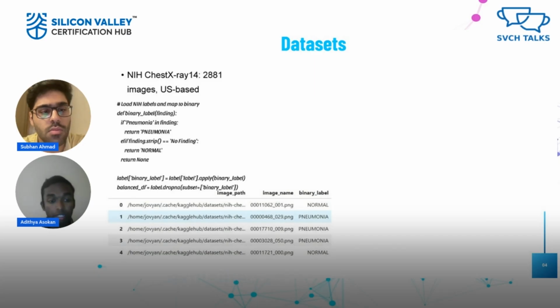As I explained before, we searched for the pneumonia and normal images, and we found that we had many more normal images. So we balanced the pneumonia and normal images. We reduced the number of normal images to, I think, 2500, to match the pneumonia images.